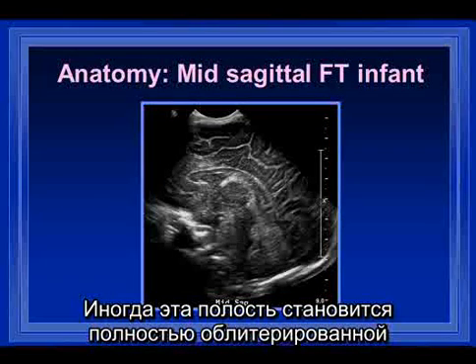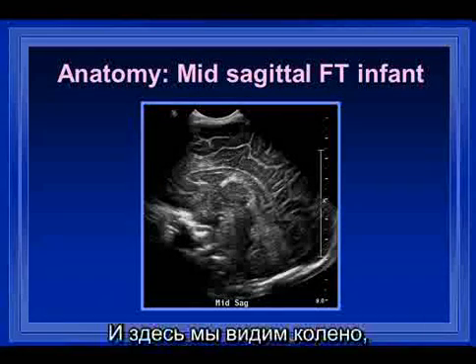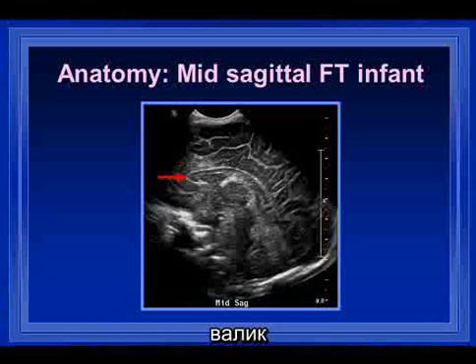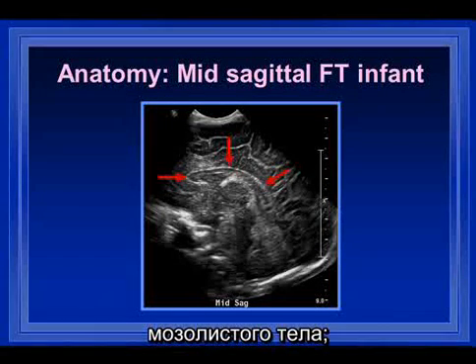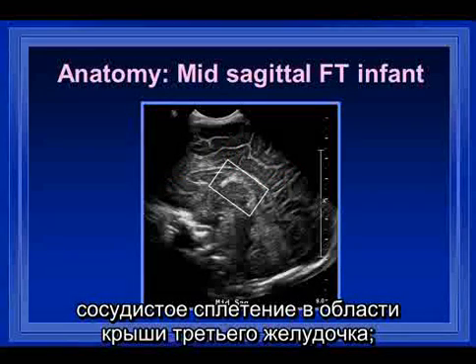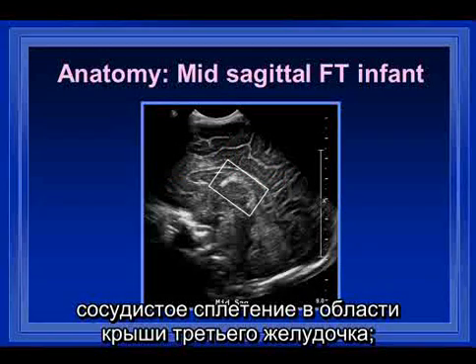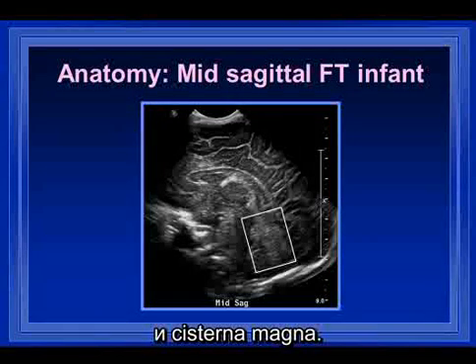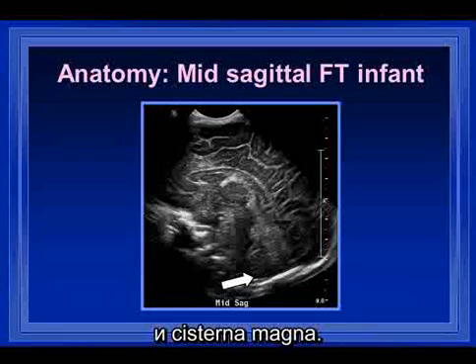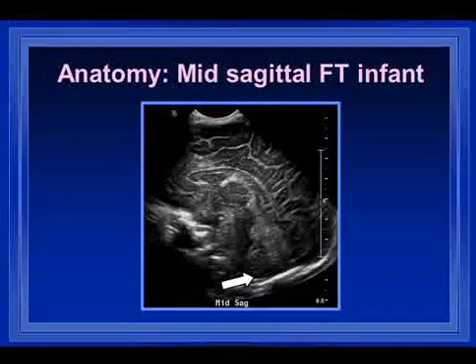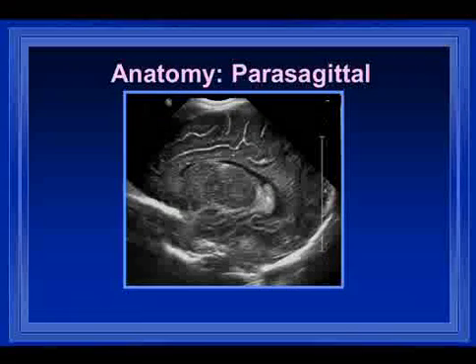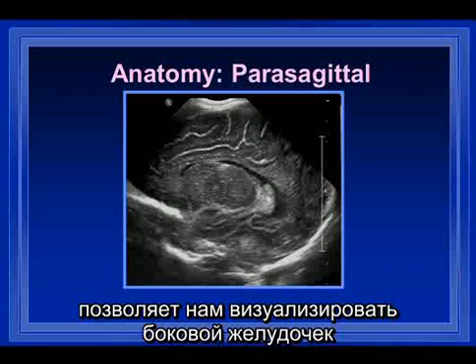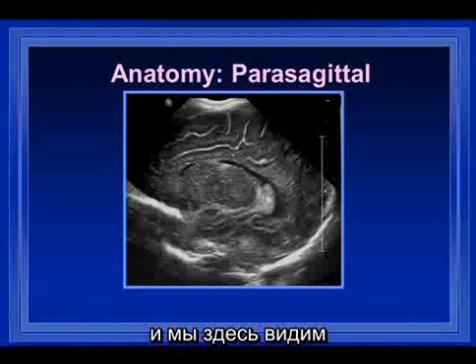Notice that once babies become full term, there is less visualization of the cavum septum pellucidum — sometimes it is totally obliterated by that age. Here we see the genu, the body, the splenium of the corpus callosum, the choroid plexus in the roof of the third ventricle, the fourth ventricle, the brain stem, the cerebellum, and the cisterna magna.